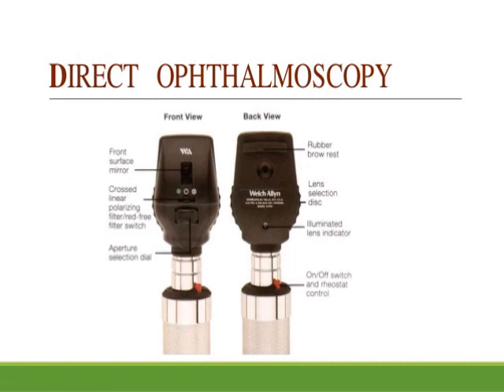Coming to the applications of distant direct ophthalmoscopy, it is used to diagnose the opacities in the refractive medium, if any, to recognize a detached retina or any tumor arising from the fundus. A grayish reflex seen on the distant direct ophthalmoscopy indicates either a detached retina or a tumor arising from the fundus, because the normal glow of the fundus is red.